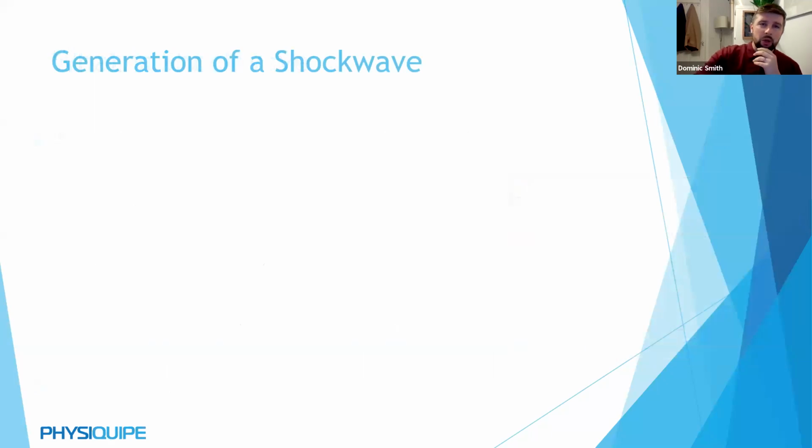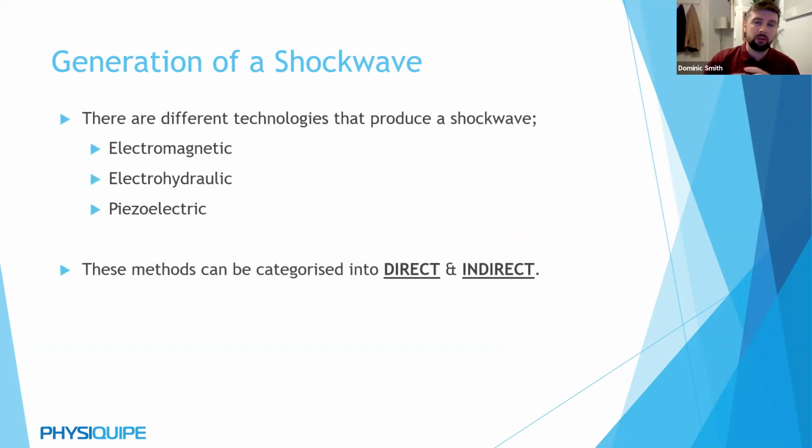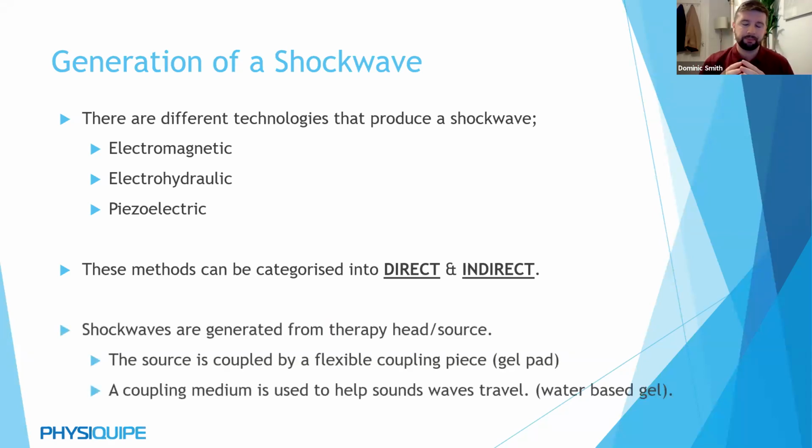So generation of shock, or generating a shockwave, how is it done? There are different technologies out there on the market. You've got electromagnetic, electrohydraulic, and piezoelectric. They're the different principles that can produce a shockwave or a true shockwave. Now, these methods can be categorized into two areas: direct or indirect production of shockwave.